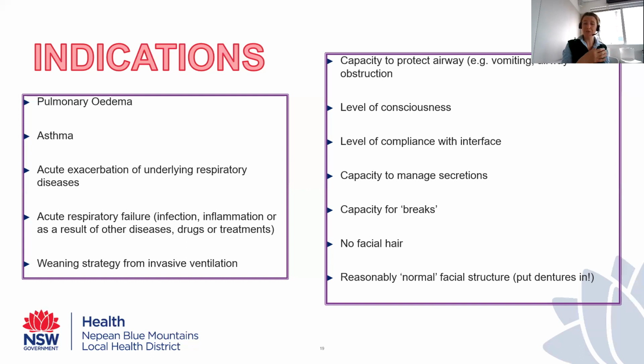And some of you who are used to looking after patients with dentures will notice you take the dentures out and their whole bottom half of their face collapses in. And it can be really difficult to get an adequate seal at the bottom of the mask if you don't have dentures. Obviously, if the dentures don't fit well, don't put them in. They can become more of a risk.